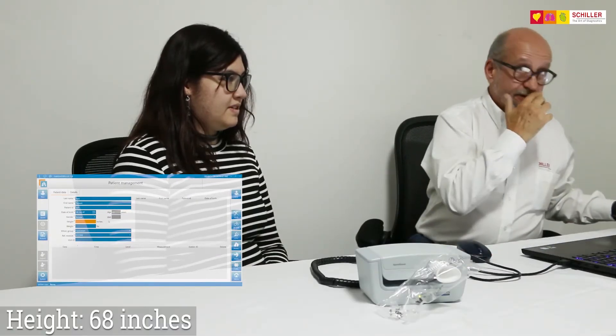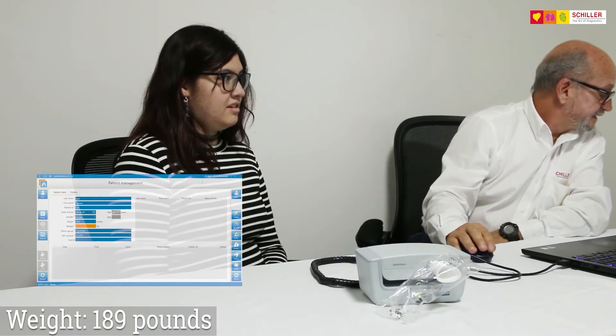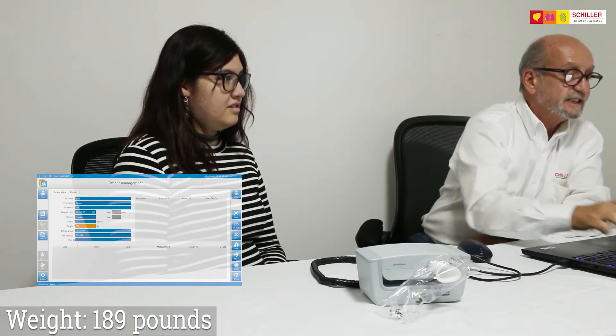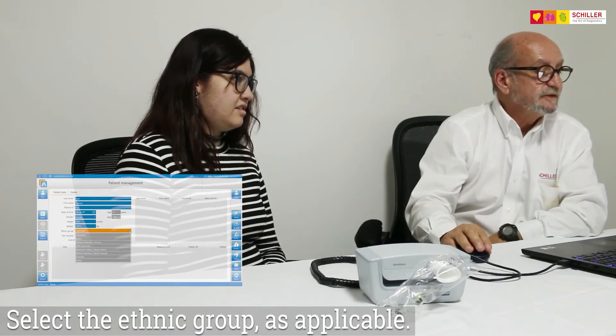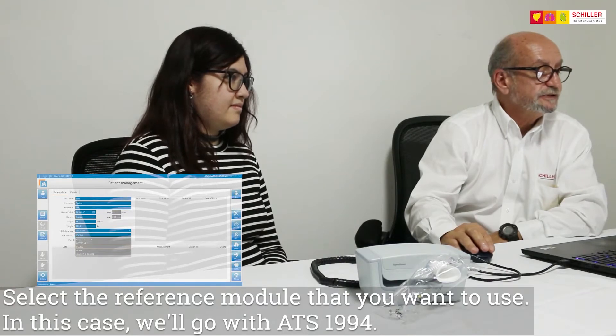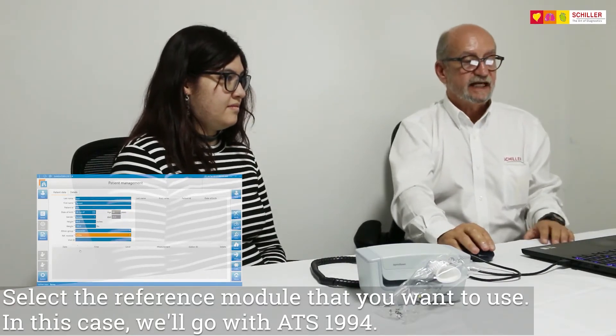Height was 68 inches and the weight was 189 pounds. Select the ethnic group as applicable. And the reference module that you want to use — in this case we'll go with ATS-1994.